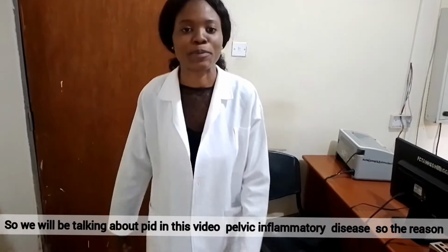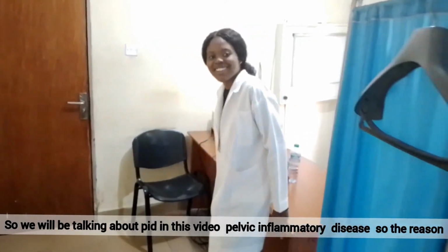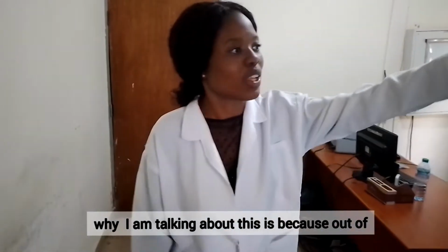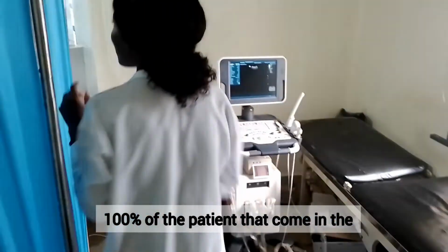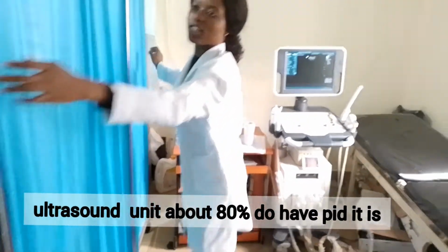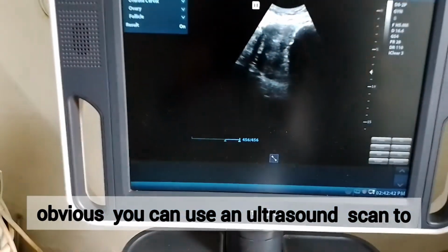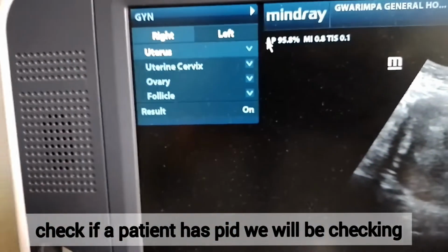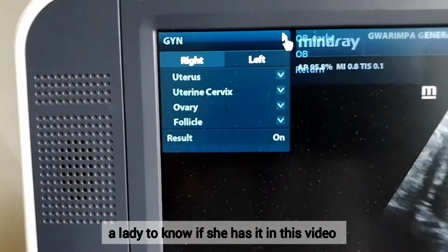Okay. So we're talking about PID in this video, pelvic inflammatory disease. The reason why I'm talking about it is that out of 100% of the patients that come into the ultrasound unit, about 80% do have pelvic inflammatory disease. It's obvious that you can use an ultrasound scan to detect if a patient has pelvic inflammatory disease. We'll be checking a lady to know whether she has it in this video.